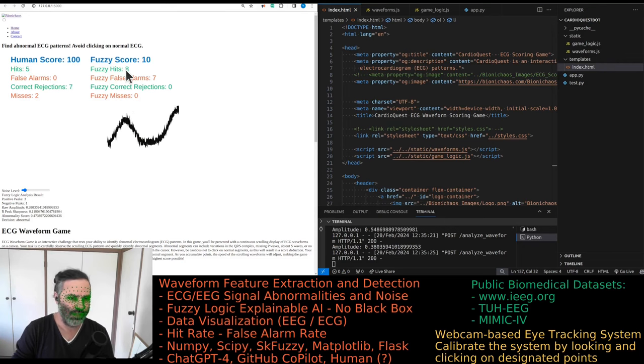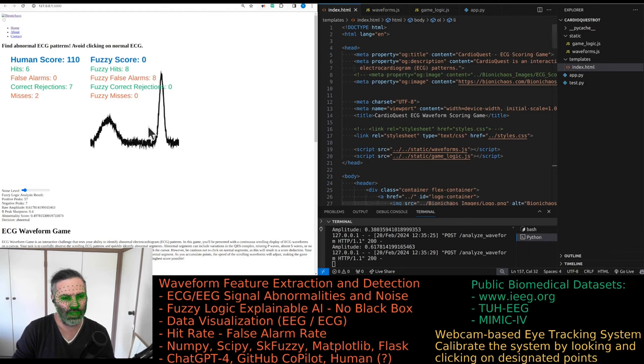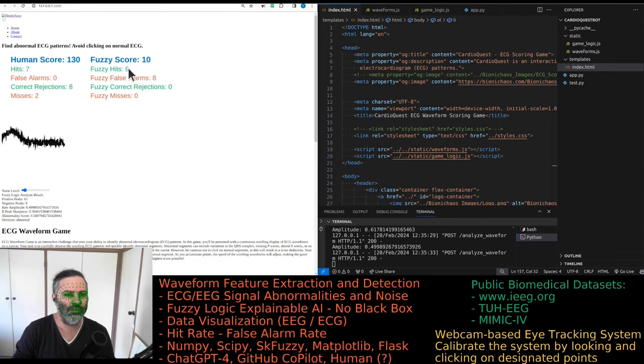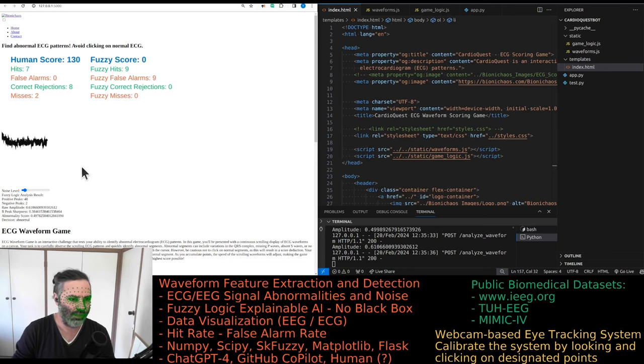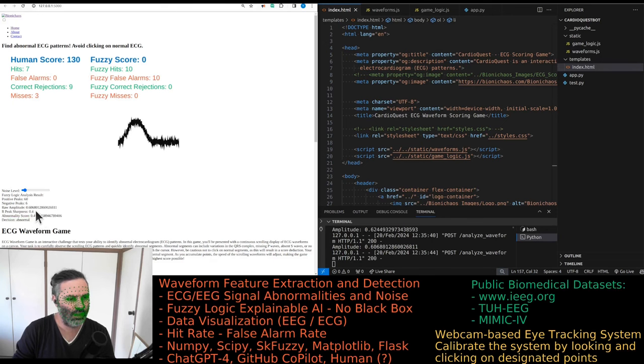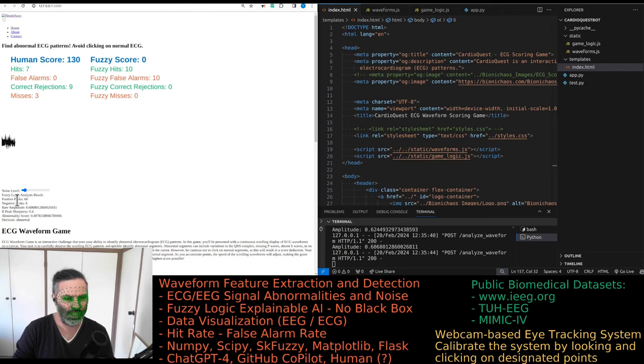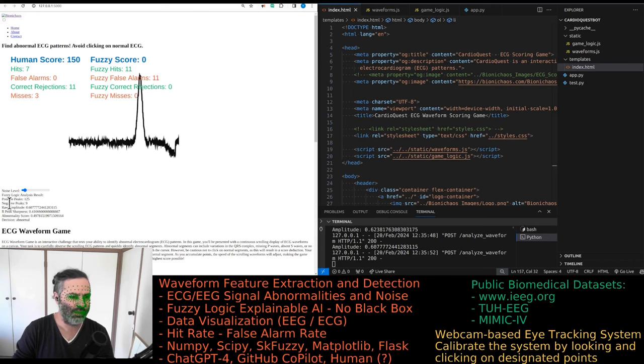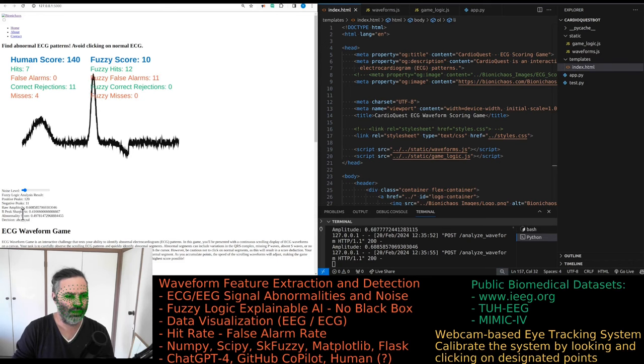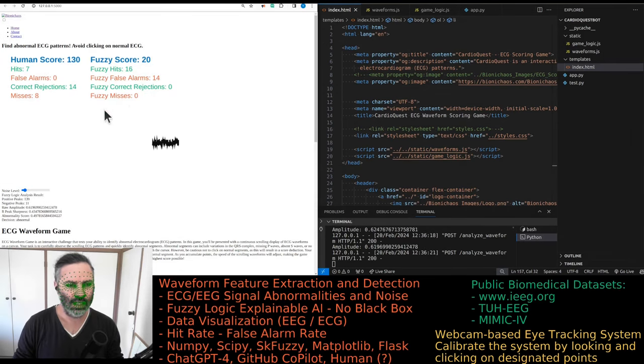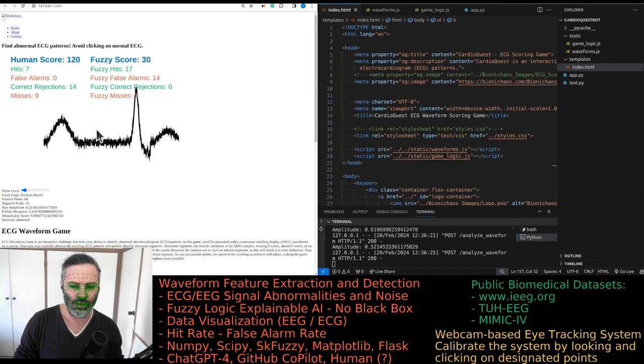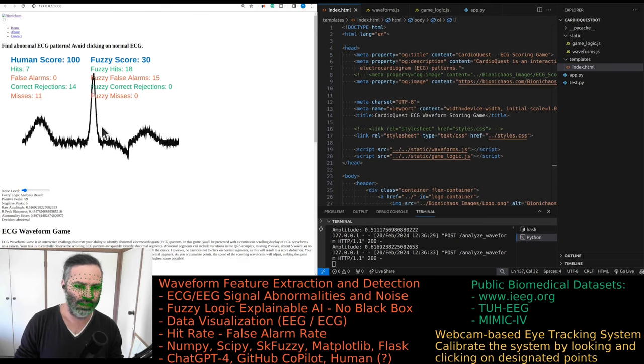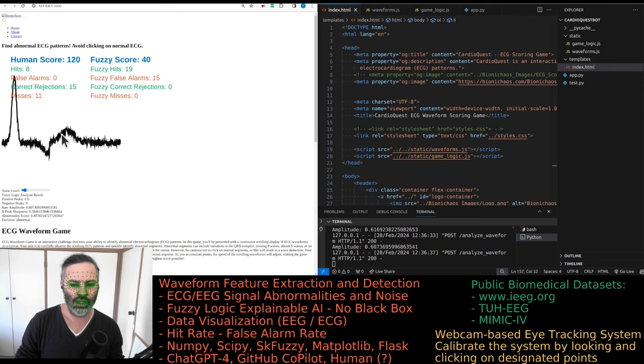We had a tuning of it before that just worked 100% of the time but it was relying on some magic numbers that we now removed. The system now performs much worse, essentially clicking on everything. We're looking at four parameters: positive peaks, number of negative peaks, amplitude, and the R peak sharpness.